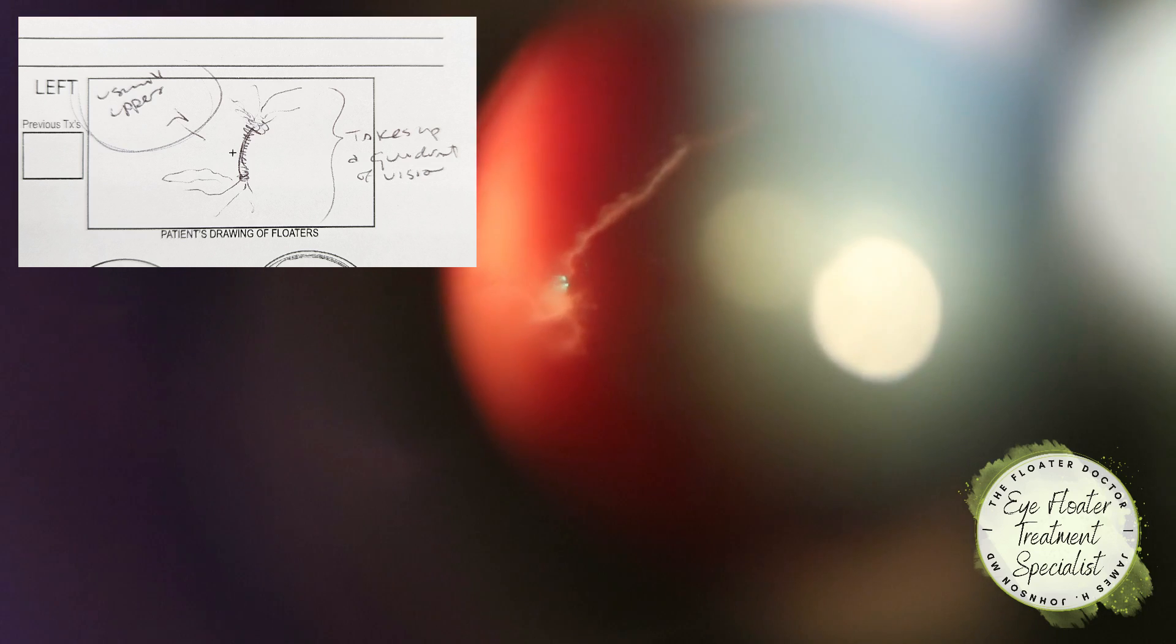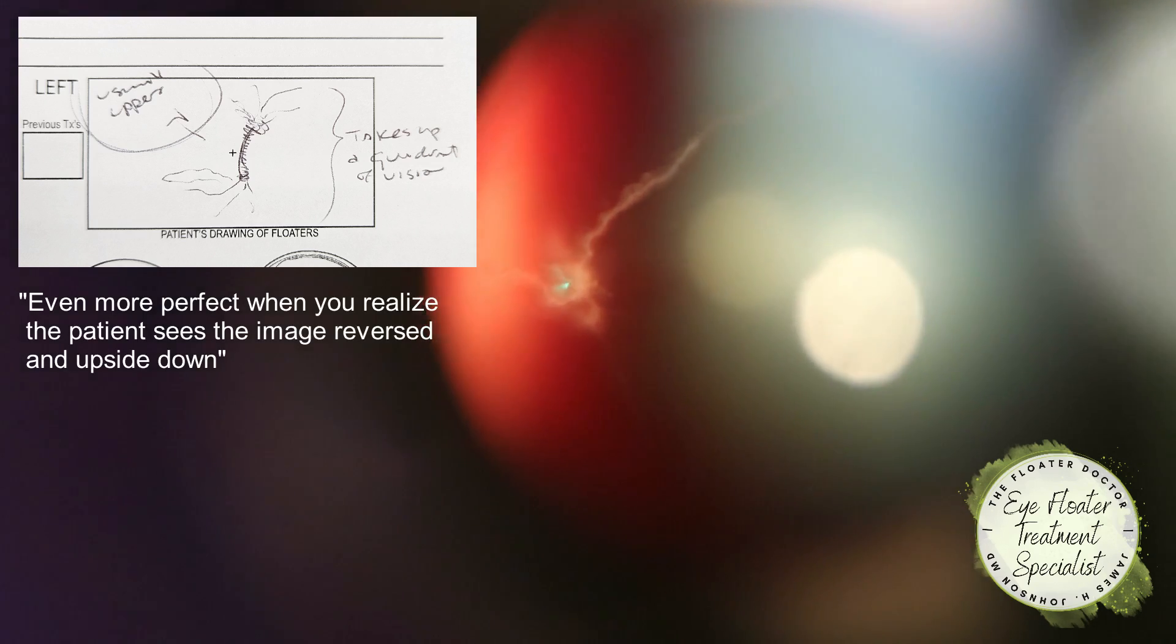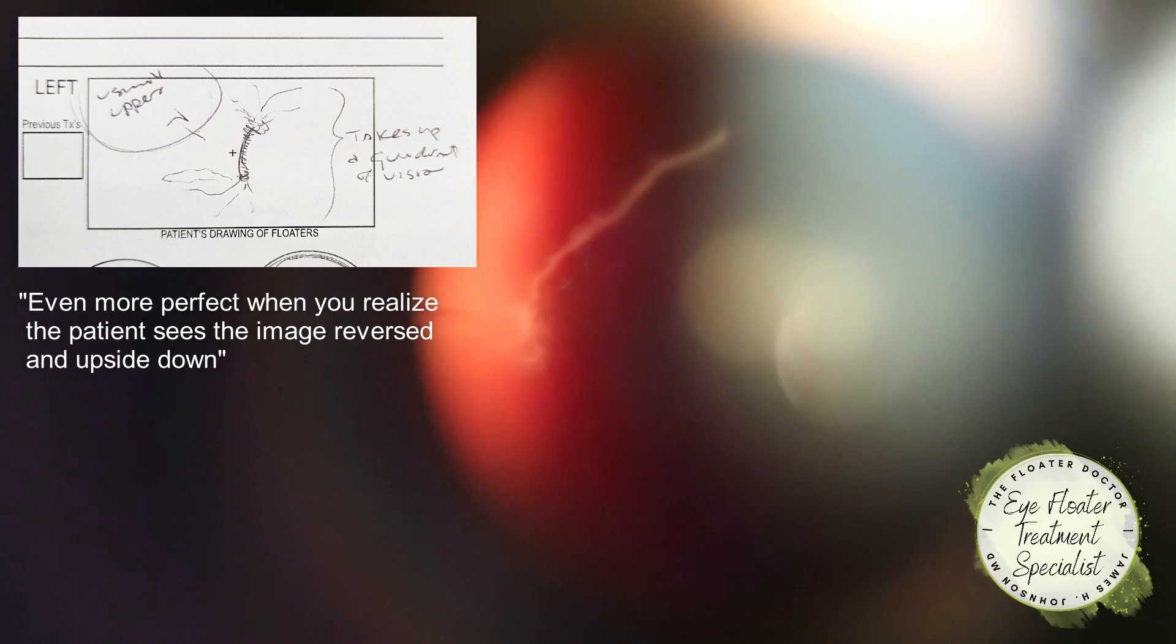So one of the things I go through when I think to myself, is this person a candidate for treatment? Can I see something? Well, yeah, obviously here. Then the other thing is, how well does the thing that I'm looking at correlate with what the patient is trying to describe? This is 100%. The drawing is perfect for this.